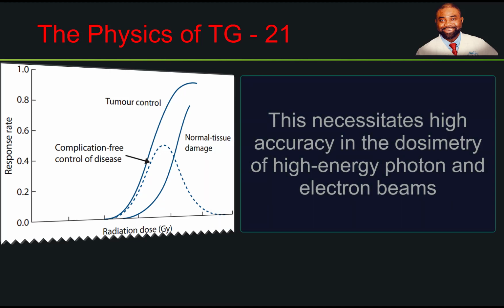This essentially necessitates the need for improved accuracy in the dosimetry of high energy photon or electron beams.